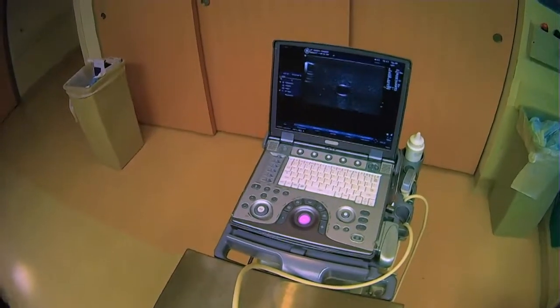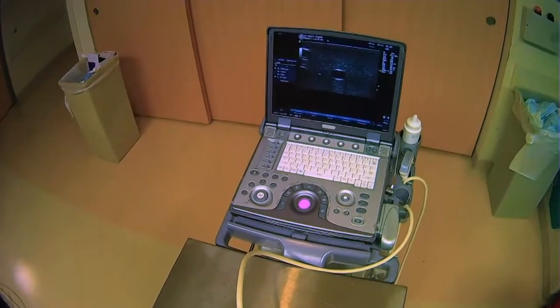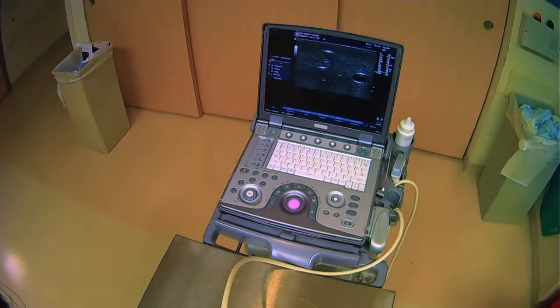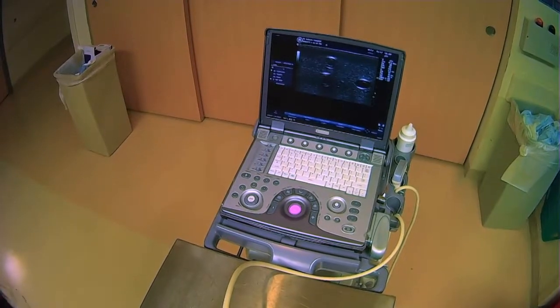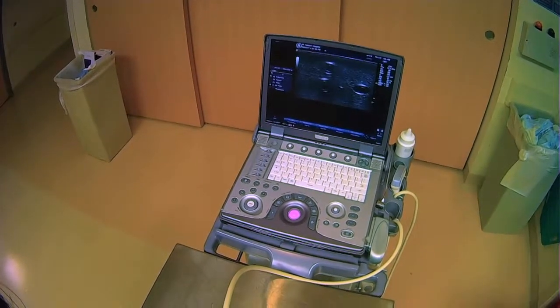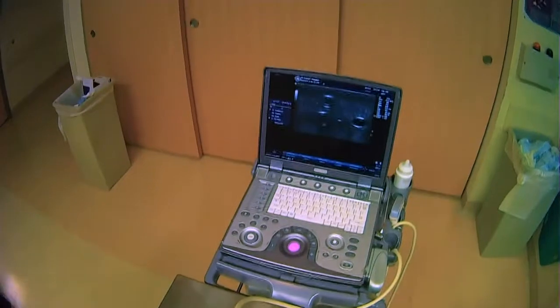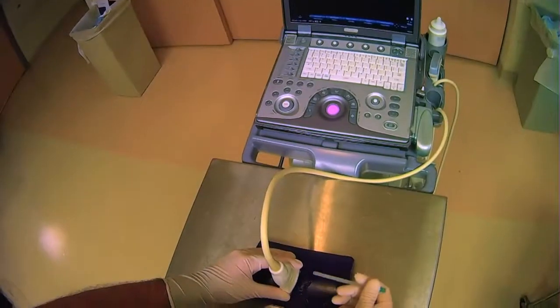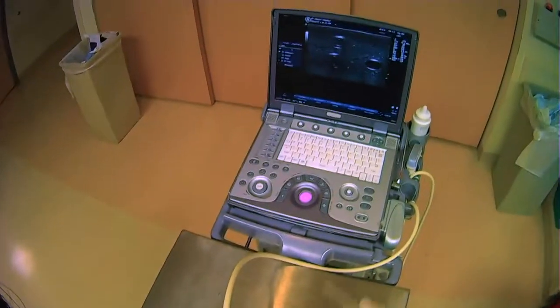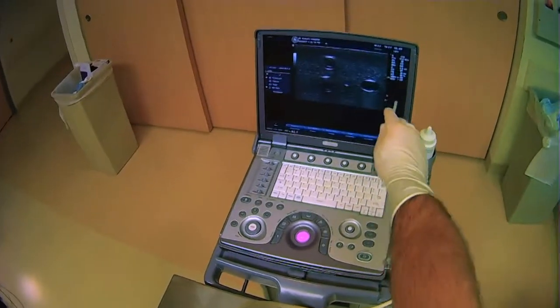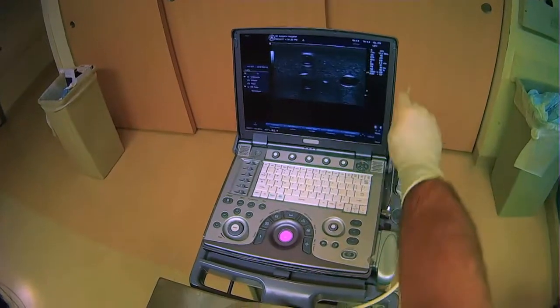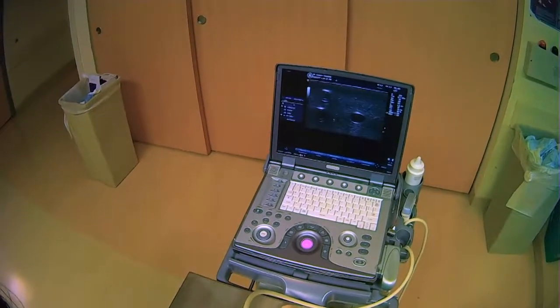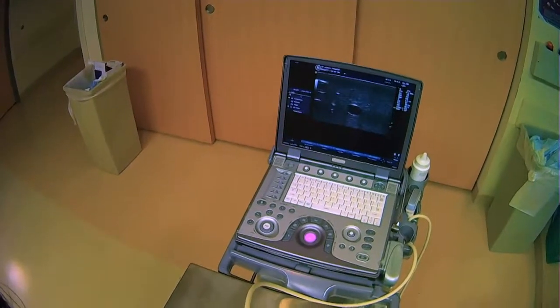Also, if we place our target in the middle instead of on the side like this, we can see the areas around it. So if we are off target, we won't be completely lost. Let's say I came in too much from the right — I won't be able to see my needle, because that will correspond to this area of the screen over here that can't be visualized. So we always want to make sure that we center our target in the middle.